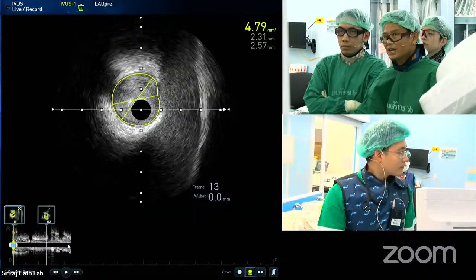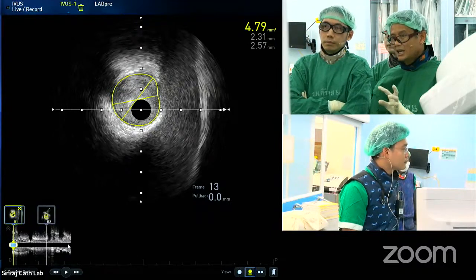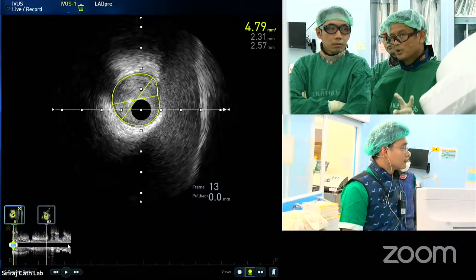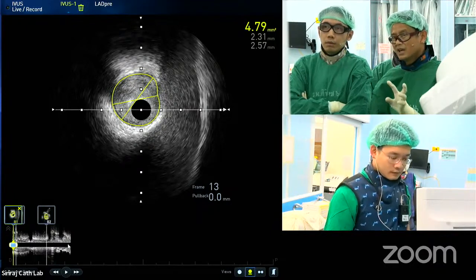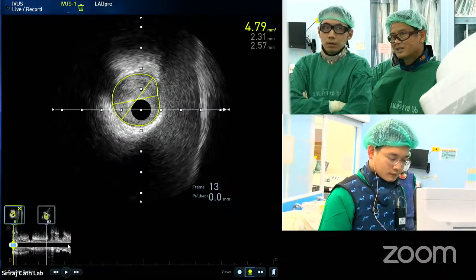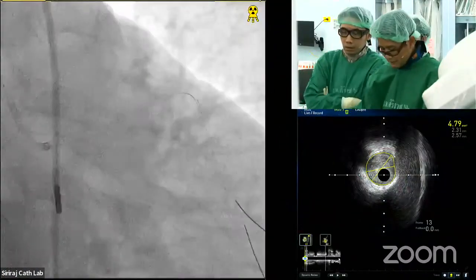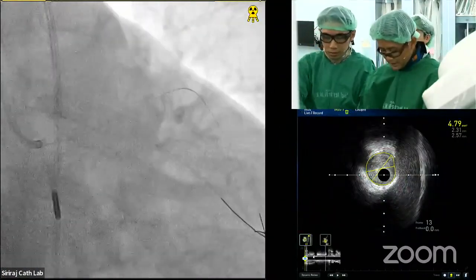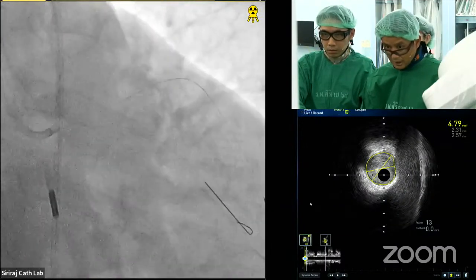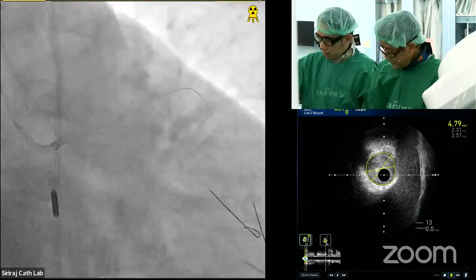So my plan is to try to stent the circumflex first, and maybe the OM first, and then we'll do provisional stenting from the left main to LAD, keeping in mind that the left main is tight, so we can open up and do the POT, and then we will do the mid-LAD afterwards. So let's start with the intravascular imaging in the circumflex after we prep with the balloon. It is engaged a little bit while we're talking. Sorry, my IVUS can pass.